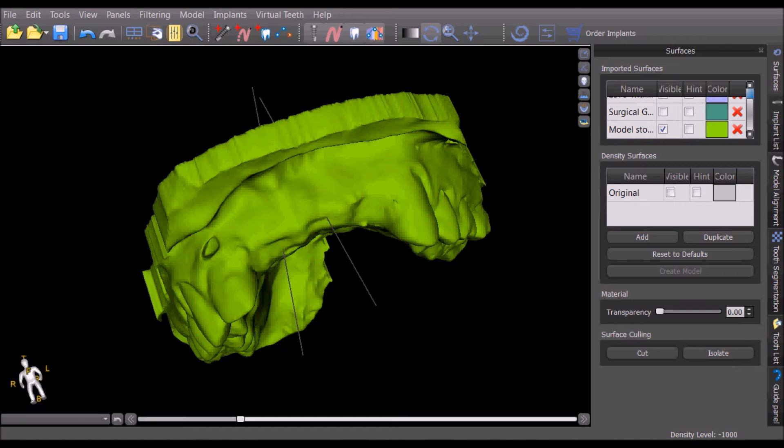The new screen share functionality makes it easier than ever to discuss and review treatment plans.